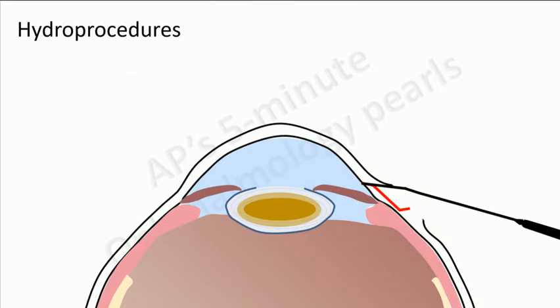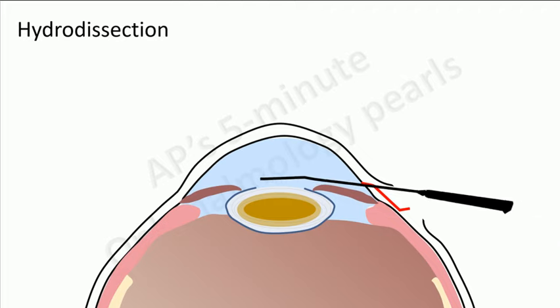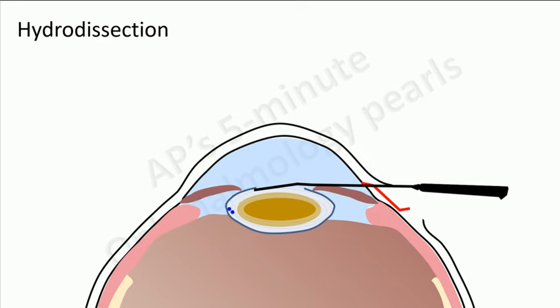Hydro procedures are employed to free the nucleus from the rest of the lens and to reduce it in size to enable easy removal from the small incision. Hydrodissection is performed by injecting balanced salt solution just under the rhexis margin. The fluid travels and separates the nucleus from the cortex and the capsule.